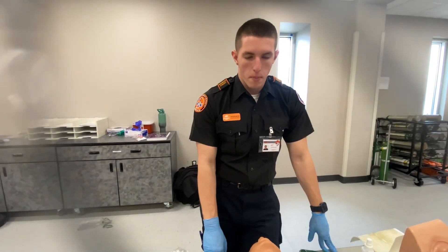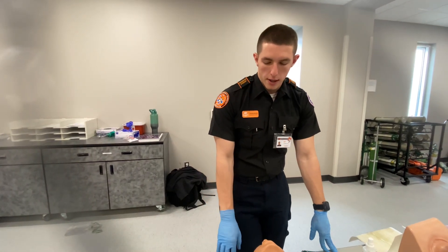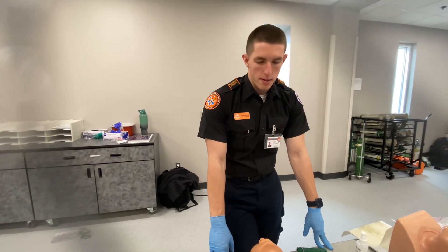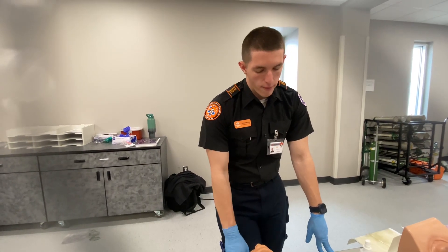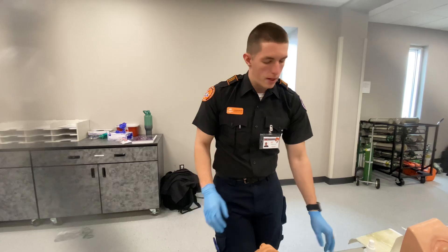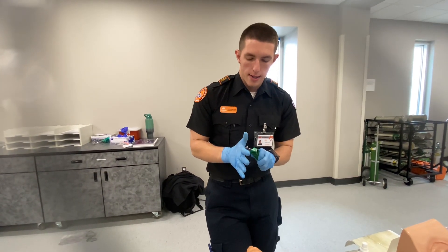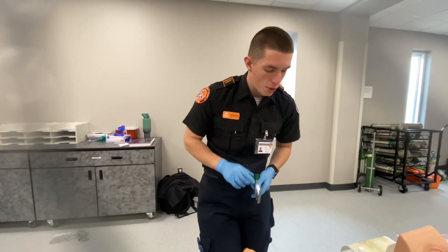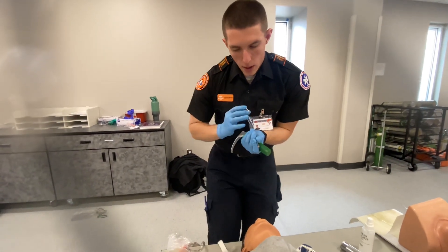This is going to be foreign body airway removal with McGill forceps. This patient is going unconscious because they do not have any air going in because of the foreign body. So we're going to get my laryngoscope with the correct attachment — this is going to be a Mac two. We're going to get the correct size of the McGill forceps.